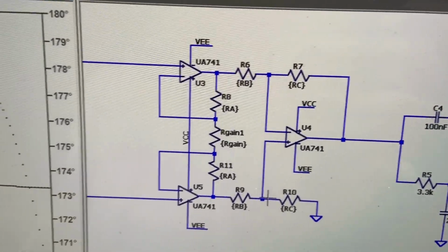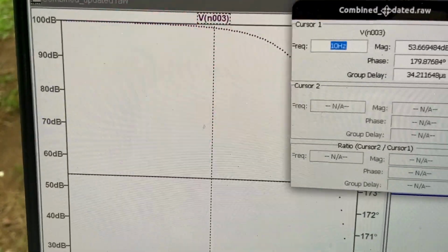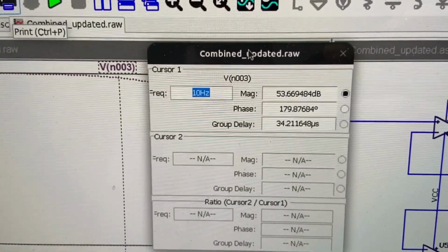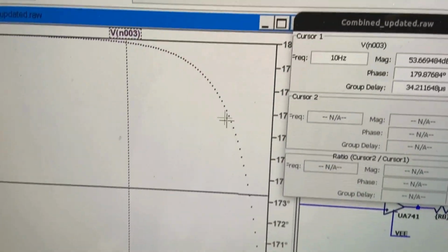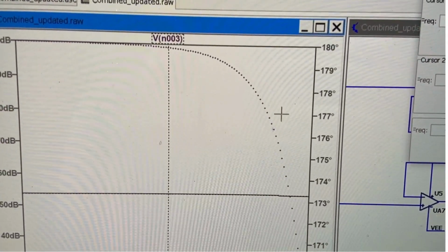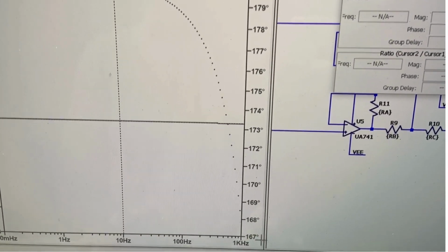Now, if we look at the gain plots, we observe that the magnitude value for the gain is roughly around 53.669 decibels, and this is the phase plot. Now, why do we observe this roll-off? The roll-off we see over here is because of the parasitic capacitances. The parasitic capacitances thereby affect the slew rate, and there's a small change in the phase difference from 180 degrees to a total of 167 degrees.